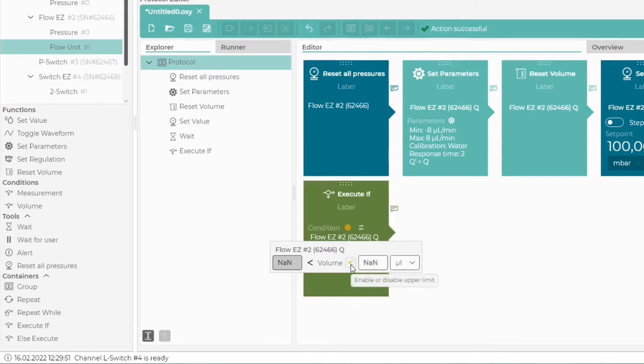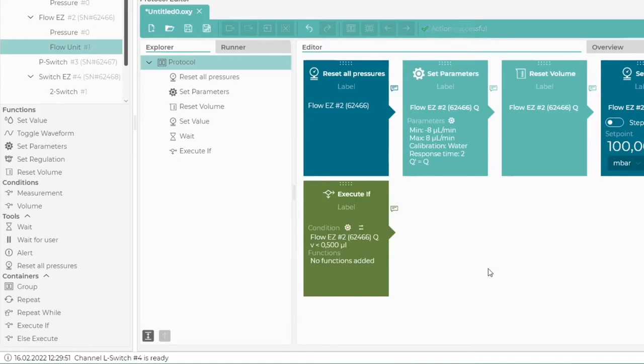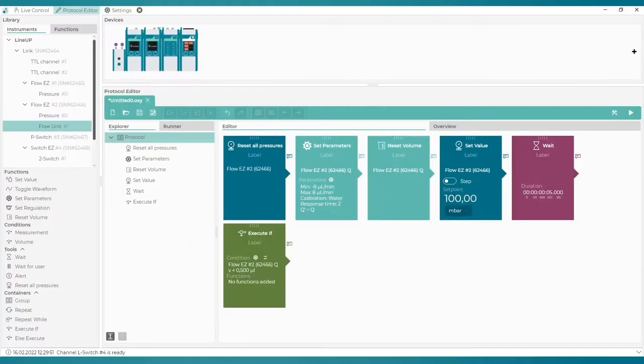Then we click on the less sign to enable the upper limit. The condition here is smaller than 0.5 microliters. We enter the value and click outside the block to enable the changes. Now we need to add an action which will be executed if the condition is true.